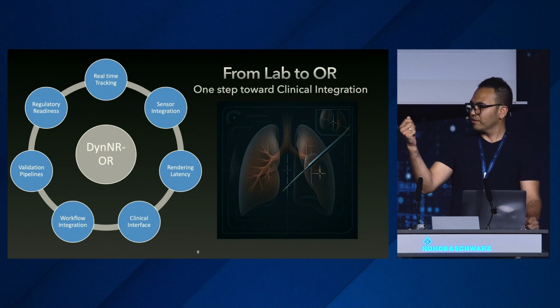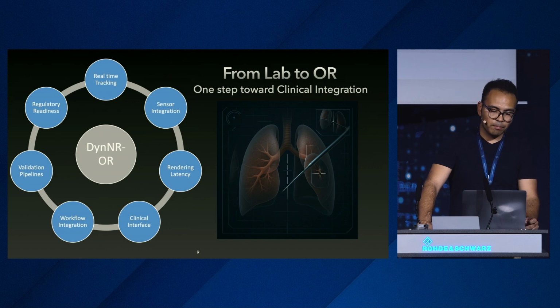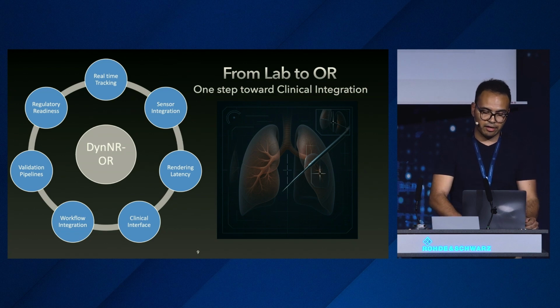So you have the probe there, and you have the 3D model in the middle. When the doctor is trying to go inside, or from outside with the scope, you can already localize yourself within the anatomy, for example. I'm really sure many questions arise on why not use directly, for example, the CT scan, and why go through a neural reconstruction pipeline at all. But in principle, this is an encoder, and this encoder is already giving us the kind of realism we want for the doctors and the operating team to visualize. And if it's good enough, why not also localize ourselves by profiting from the localization algorithms that we already have?